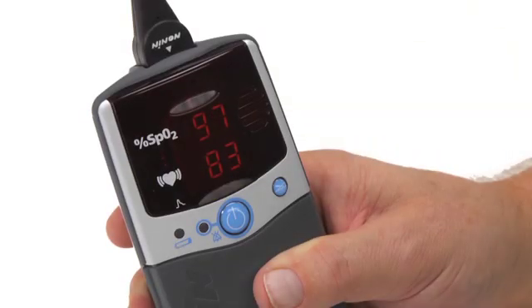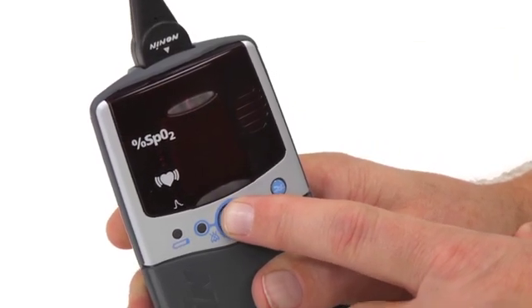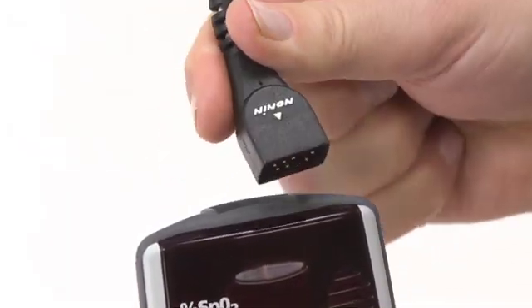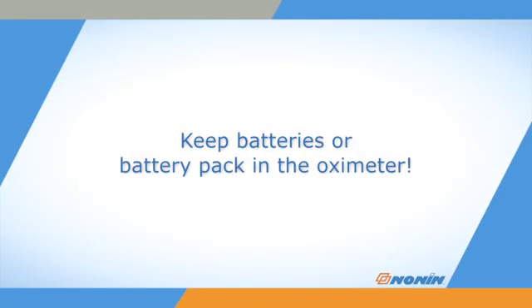When you are ready to stop using the oximeter, simply press and hold the on-off button until the unit turns off. Then you can unplug and remove the sensor. Always keep the batteries in the oximeter to retain settings and stored data.